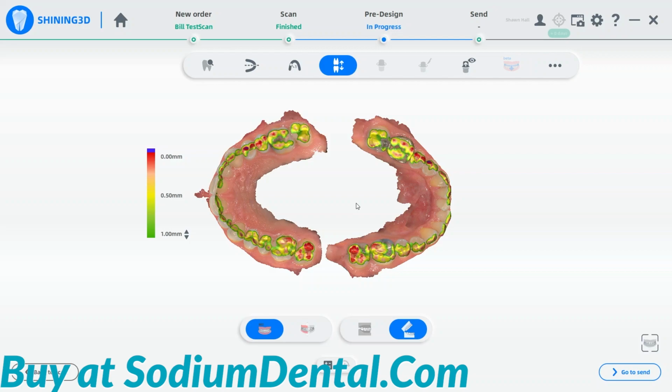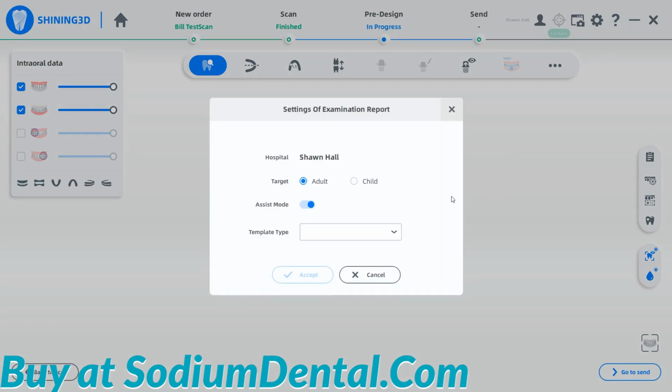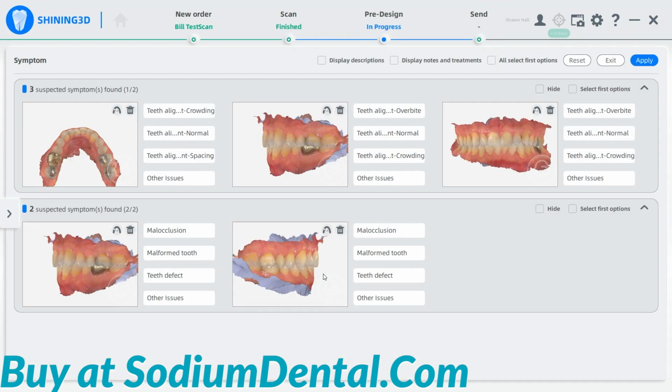Now at this point, you are prepared to either use this scan for an oral health conversation, at which point we would click the magnifying glass on the tooth and choose the clipboard over here for the consult report to produce an oral health report. Your oral health report will first start by analyzing the model, and the AI built into Shining's intraoral scan software will make some suggestions of symptoms should you agree with them. If you do, you can click on them and it will add them to the oral health history report with no work on your part.